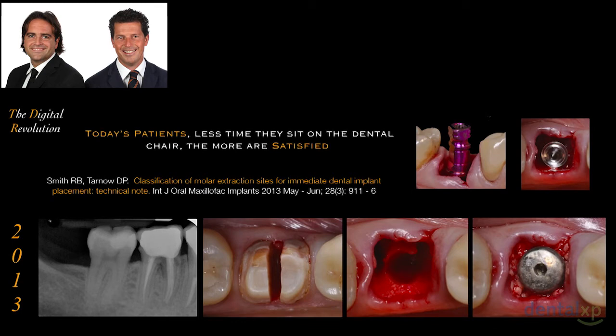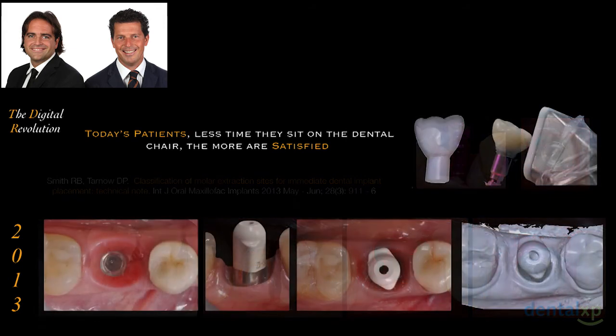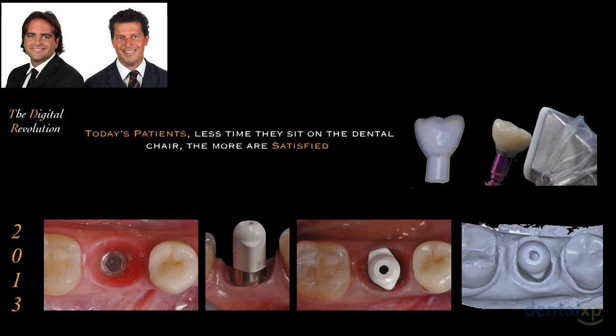And let's take into consideration this case from 2013 of these failing molars. Of course, biology and the literature are always helping us. So we need to know how to extract a molar, define which kind of socket this specific molar has, and place the correct implant with the proper dimension and in the proper position in all the three-dimensional space of the socket. And then once we waited for the healing of our implants, we place a provisional restoration, paying a lot of attention to all the esthetic and functional parameters of our provisional restoration.